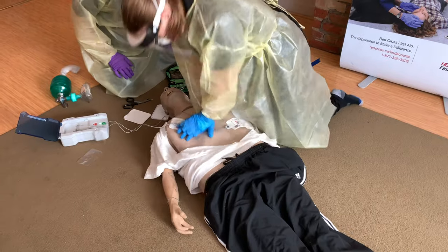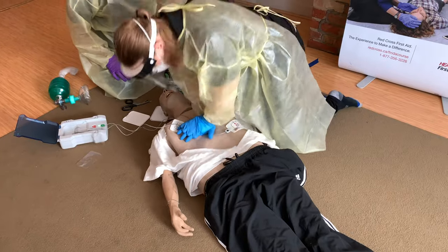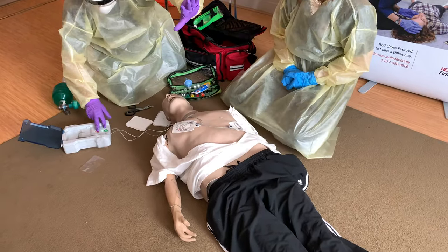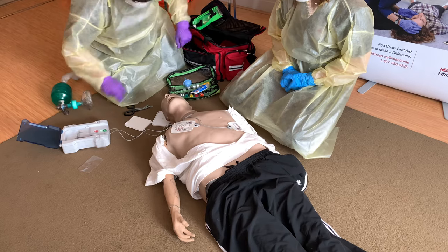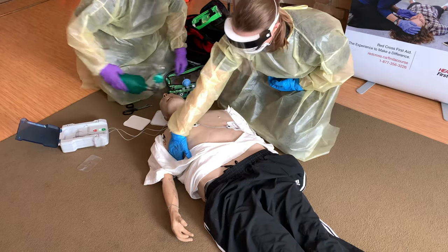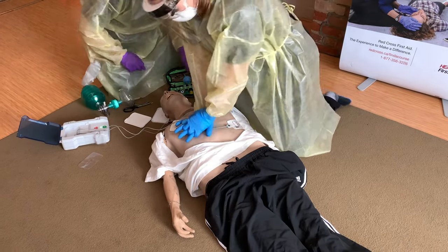Do not touch the patient. Confirm no one is touching the patient, then deliver the shock. Begin CPR immediately after the shock is delivered.